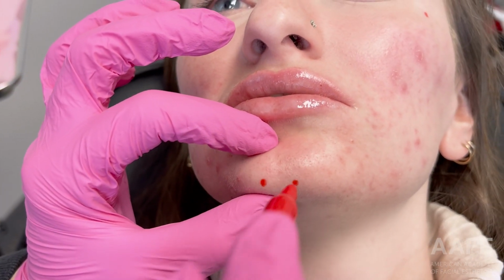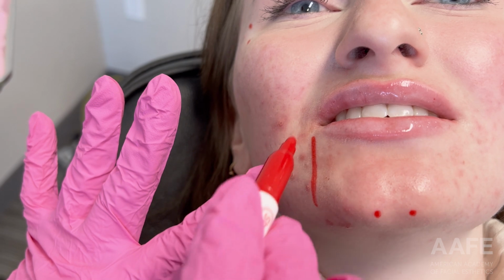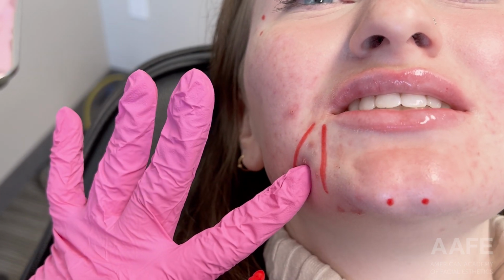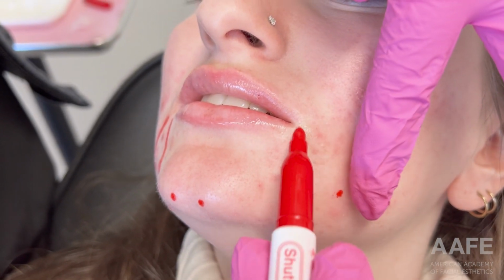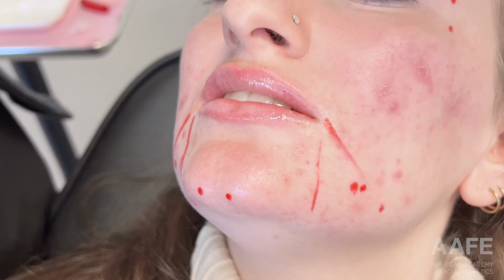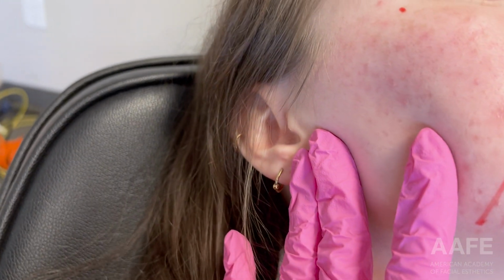I'm moving down to the lower face. So I'm marking mentalis and DAO just to kind of relax that pull, to make sure that we are not contributing to that early jowling, pre-jowling, that is constantly pulling and creating that saggy lower face that we don't like. So much more of a preventative treatment.